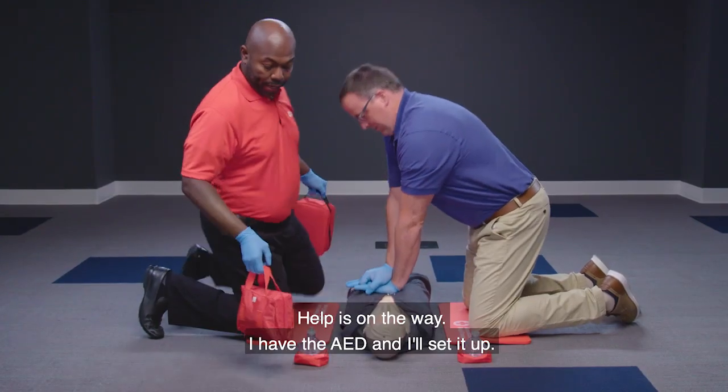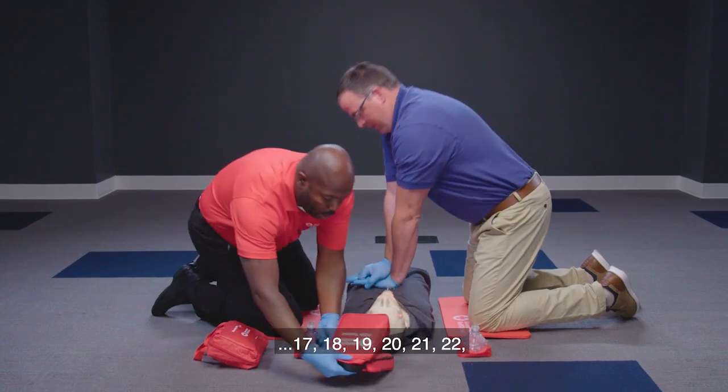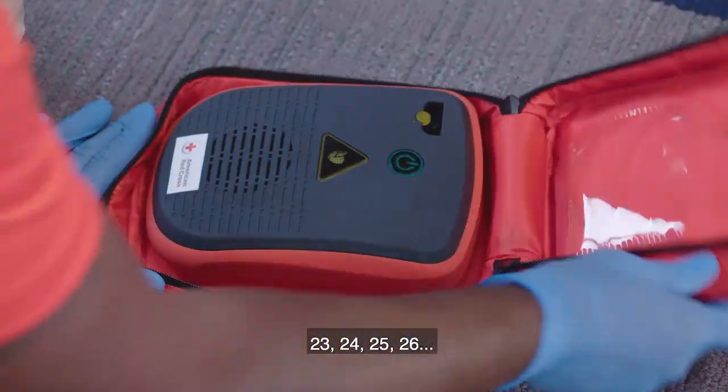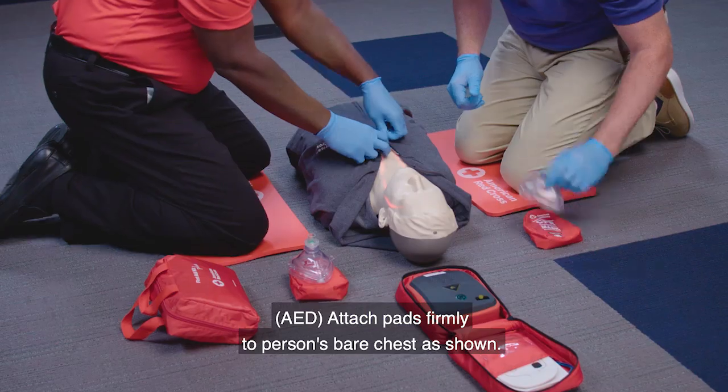Help is on the way. The second responder returns with the AED and begins setting it up while the first responder continues CPR compressions. The AED instructs: 'Attach pads firmly to the person's bare chest as shown.' The connector is plugged in.